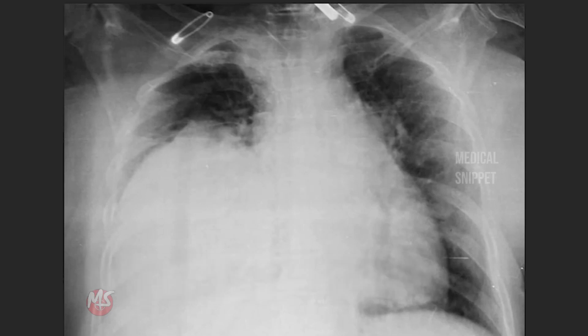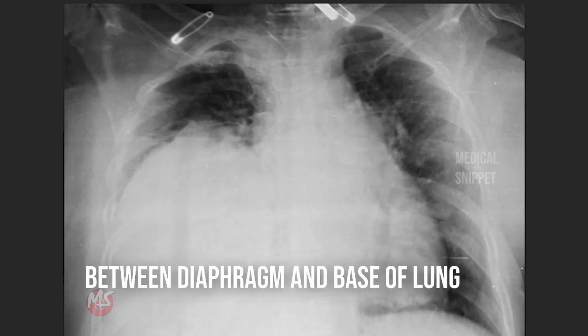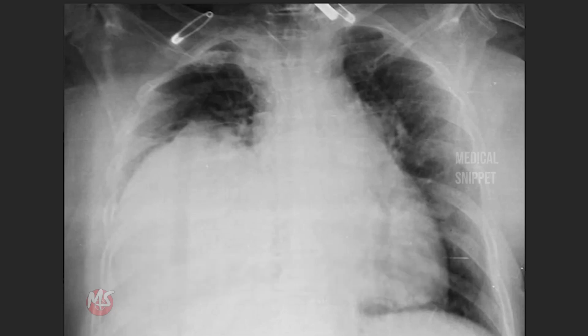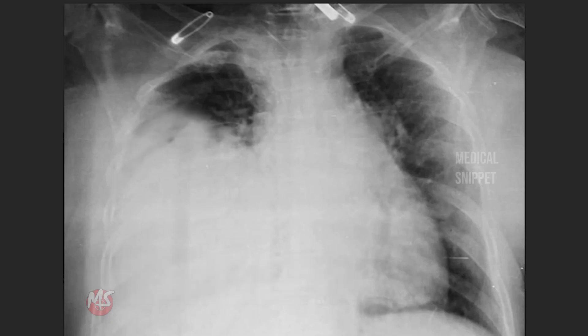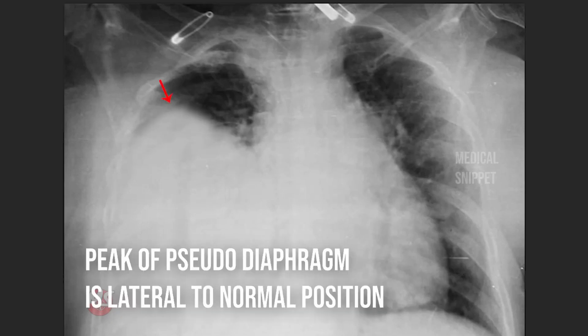Sub-pulmonic effusion is effusion between the diaphragm and the base of the lung. In this case, the peak of the pseudodiaphragm is lateral to the normal position. So this is also not sub-pulmonic effusion.